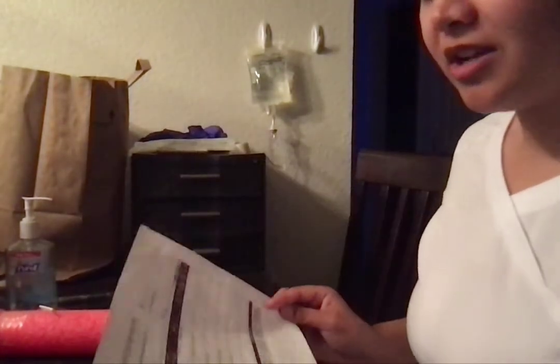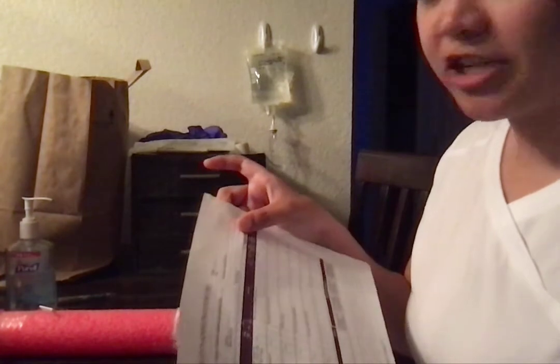I have my MAR here. Sorry, I have my patient in front of me. Let me go ahead and reposition you and hopefully you can get a better look at everything. Okay, so I'm going to look at my MAR first, and I'm going to look at the patient name and date of birth, which is Millie Larson. Date of birth is 1/1/1936. According to her MAR, she has no known allergies.